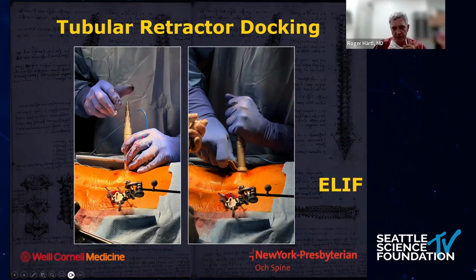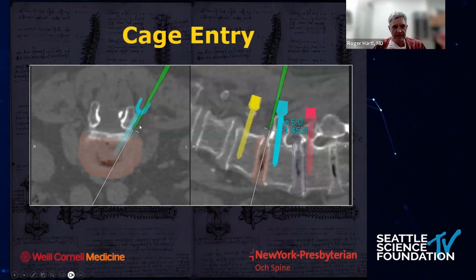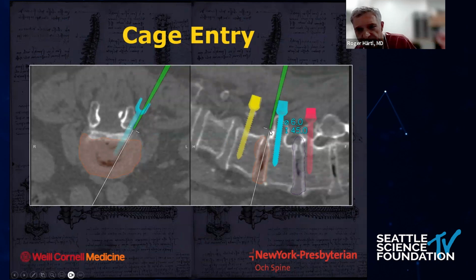This is the reference array for the navigation. And then on the contralateral side, I already drilled the holes for the screws, but then because I go more lateral, I put the tubular retractor where usually the screws would be. And this is with navigation. This is the trajectory that you see then through the tubular retractor. This is the entry point for your discectomy. So you're lateral to the facet joint, and these screw holes here, I've already drilled them and I've marked them here in different colors so I can find them afterwards very easily once I take the tube out.